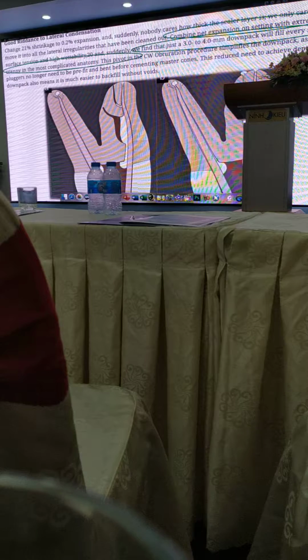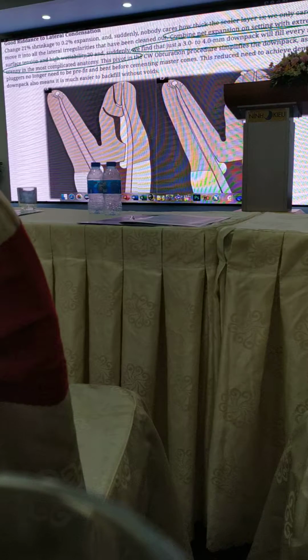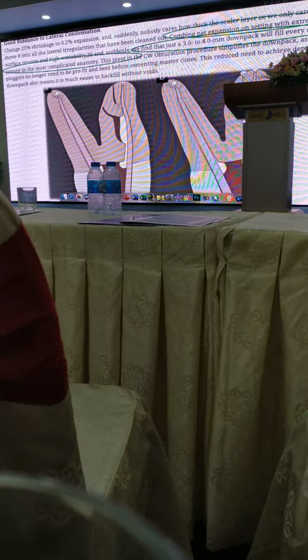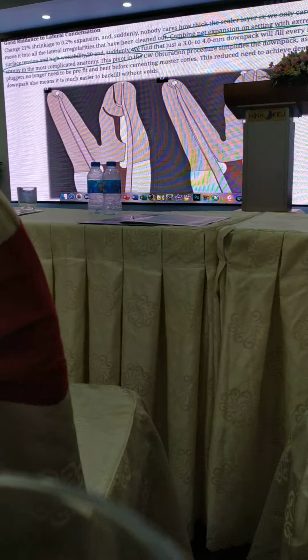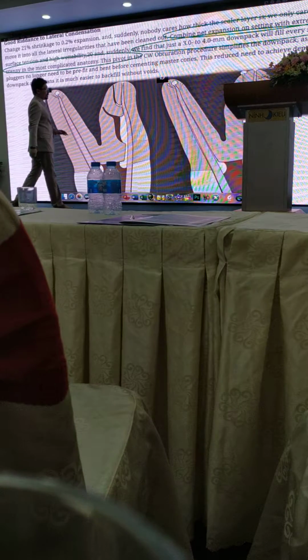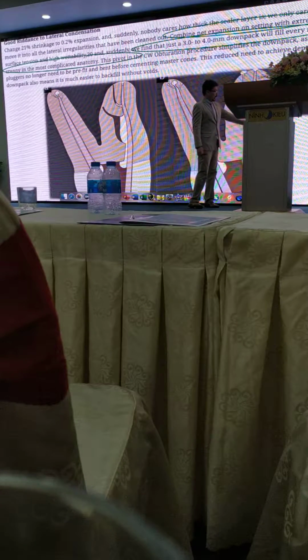In this kind of case, we can combine the techniques, and we can go with the thermoplasticized obturation technique for compacting the master cone, but we are not going to compact the master cone to the apical area. We are going to compact the master cone just at the end of the coronal third.